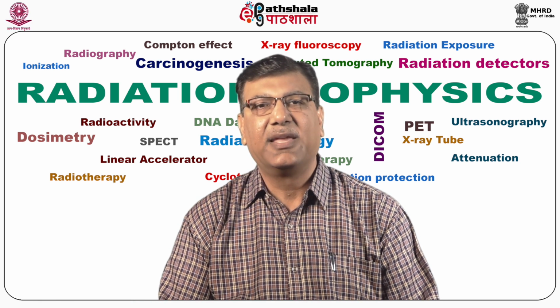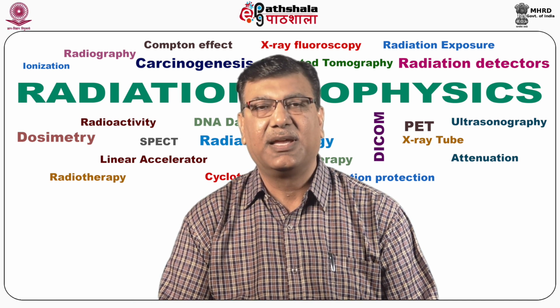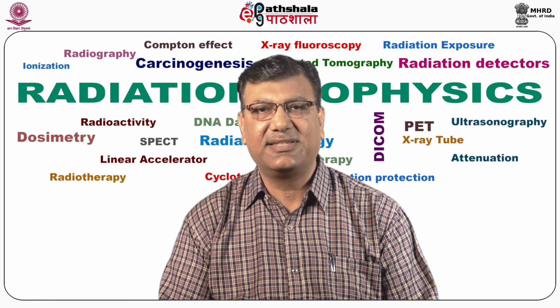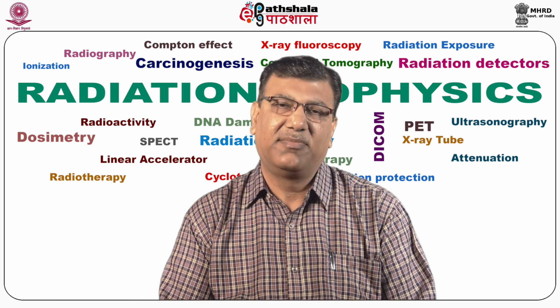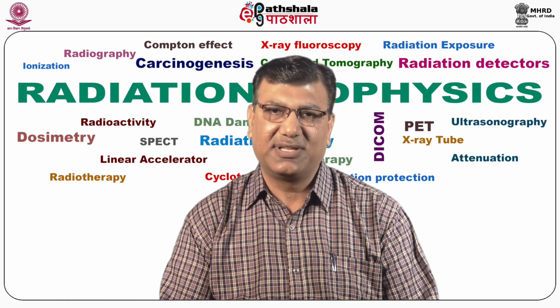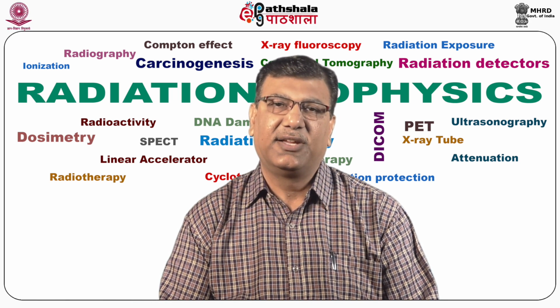Interstitial therapy is used in cases of soft tissues, breast cases, etc. And all surface cancer cases are treated by using a mold, placed on the surface, and the dose is delivered on the surface.